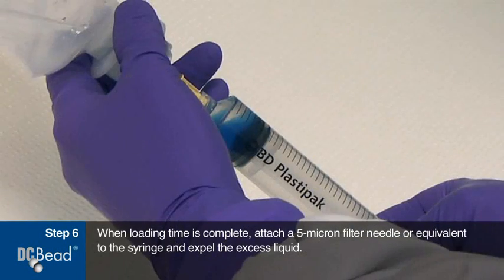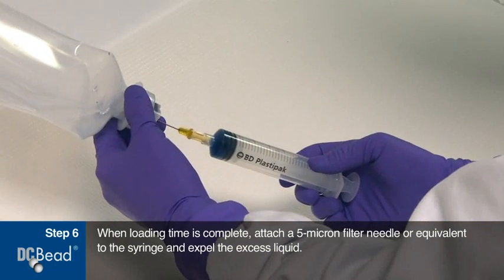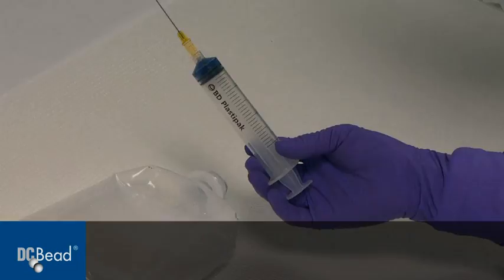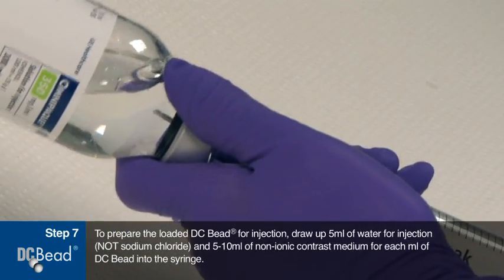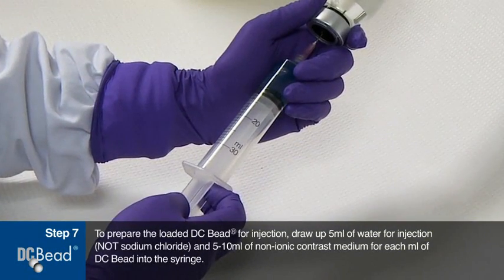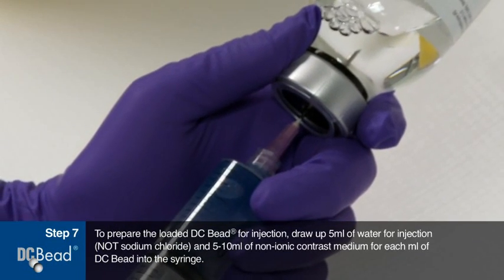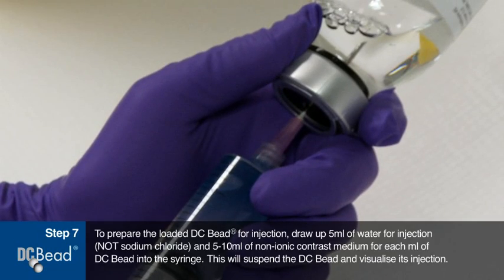Remove the syringe and expel the excess liquid. To prepare the loaded DC bead for injection, draw up 5 millilitres of water for injection — not sodium chloride — and between 5 and 10 millilitres of non-ionic contrast medium for each milliliter of DC bead into the syringe. This will suspend the DC bead and visualize its injection.